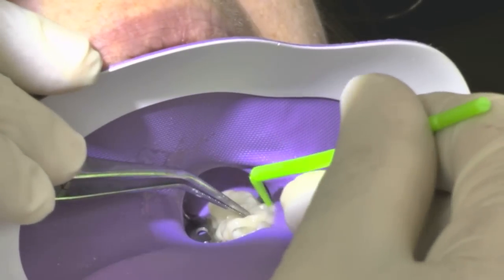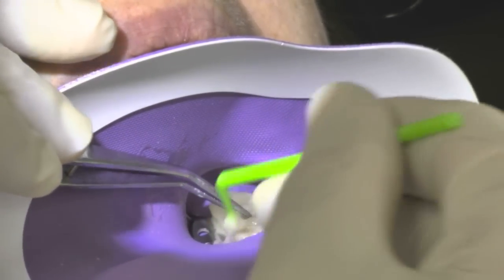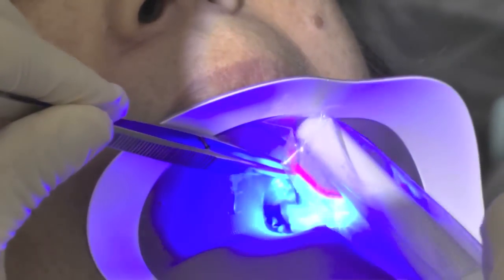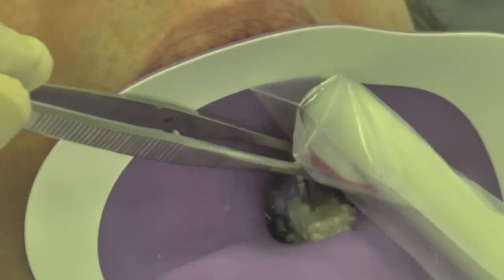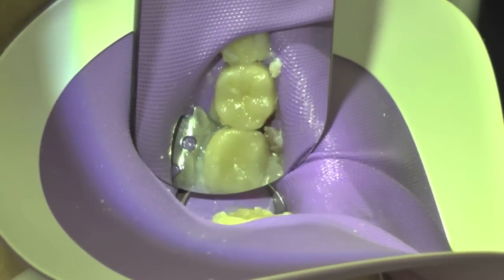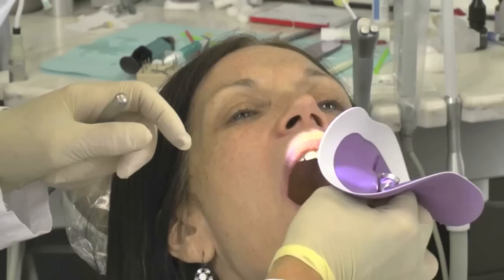The excess is cleaned up. Then we light cure to ensure complete polymerization of the material. The final cleanup is done under the rubber dam and then it's removed.